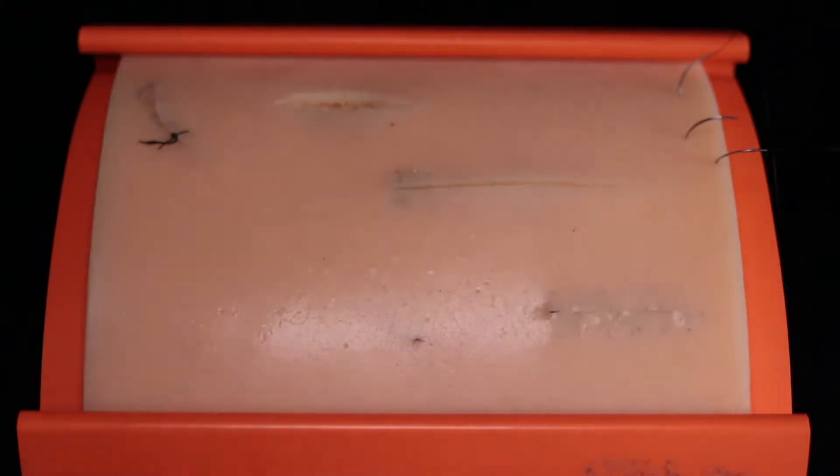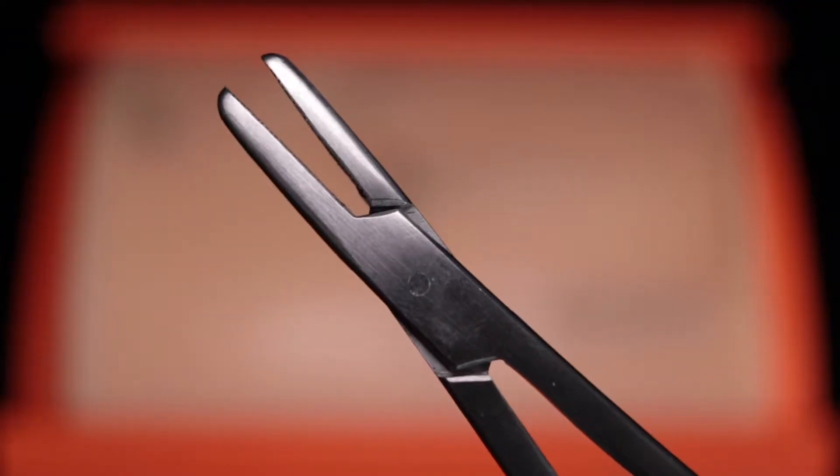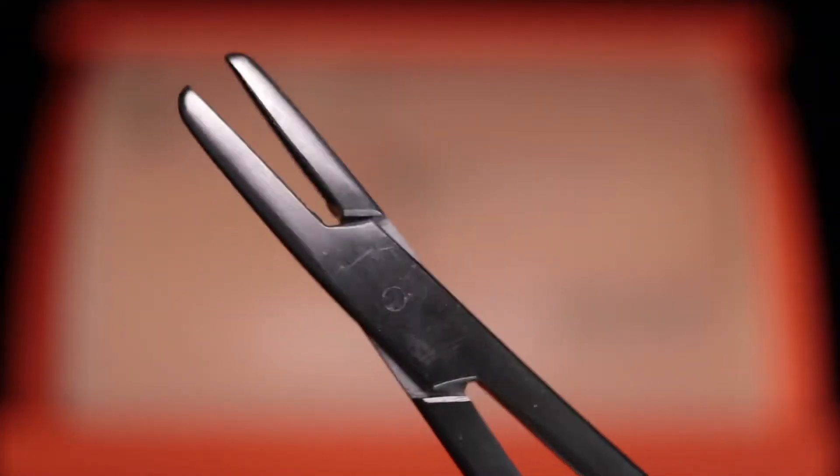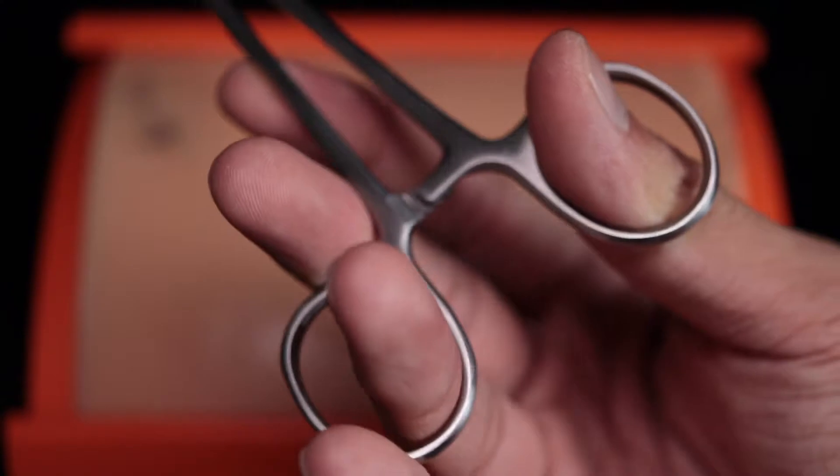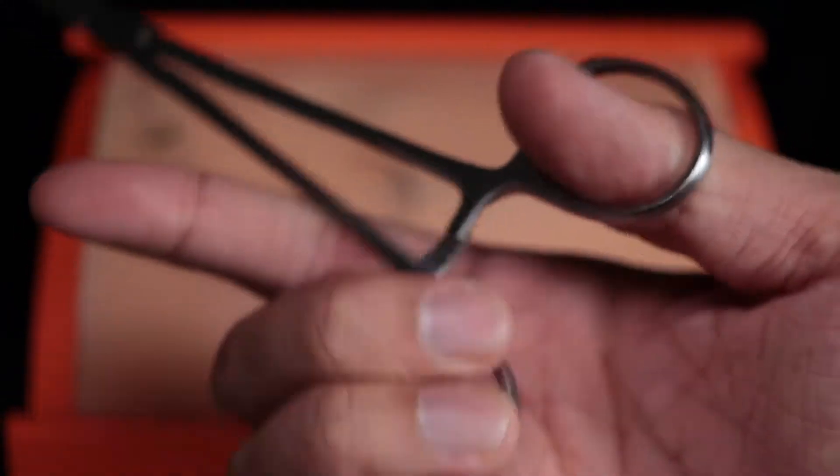This isn't a suture video, but I do recommend getting a suture pad which includes a needle driver. You can use whatever grip you like as long as you can open and close the needle driver easily.